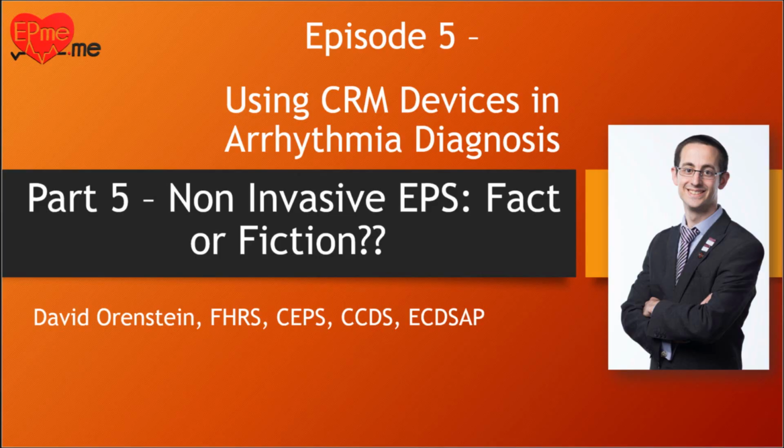We can use information from the separate leads during, for example, a tachycardic event to analyze and really find out what's happening to the patient. This is good for the patient as it means avoiding further invasive EP studies, and helpful for us because we can make a more informed and timely decision about the treatment routes for that patient.